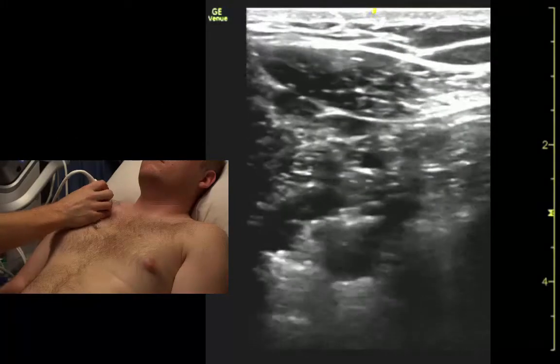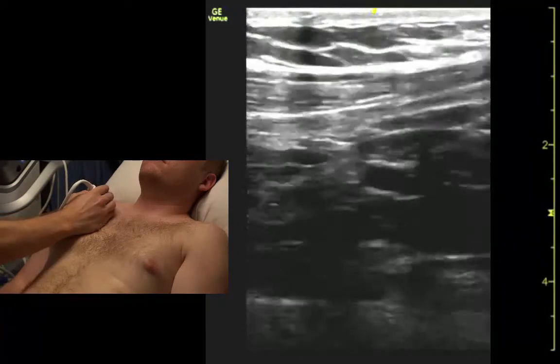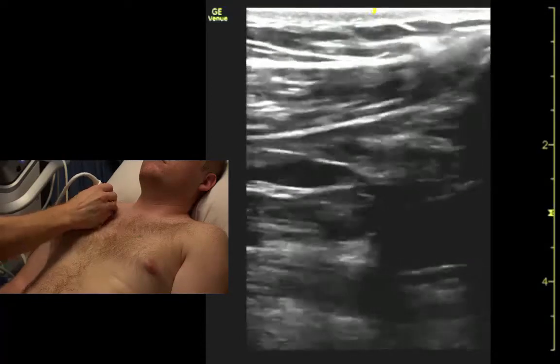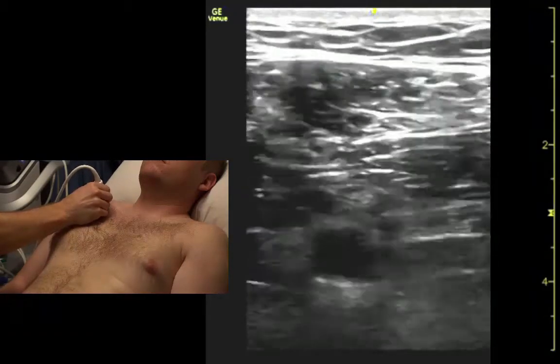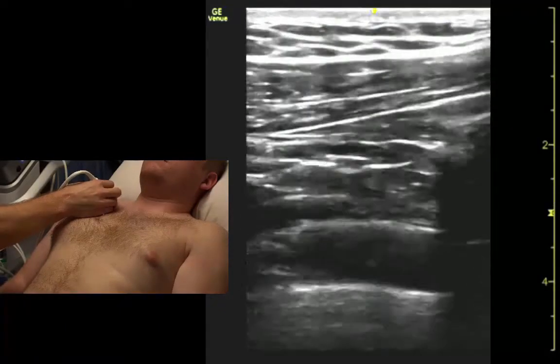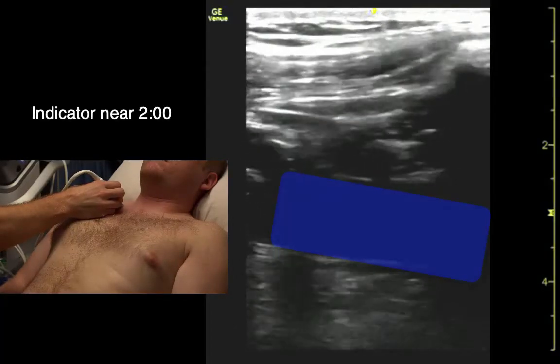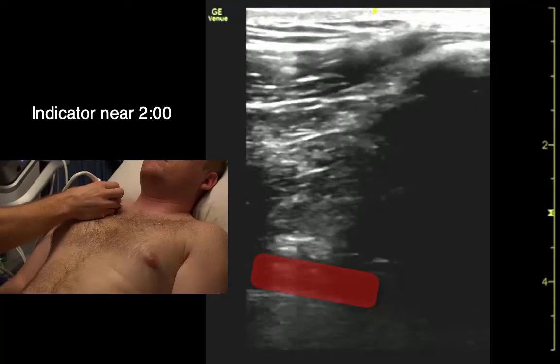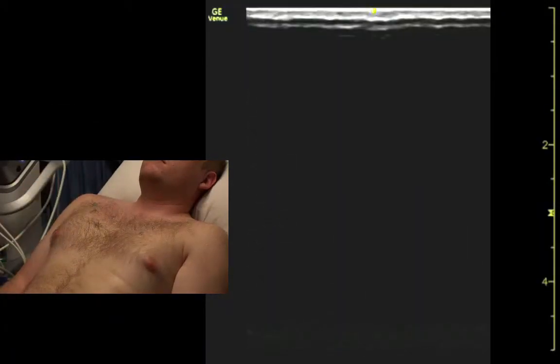If we're not sure, we can lie them back. That's a good target for central access too. Bear down again — there's the vein, we could target that for central access. The artery's a little bit deep. Or if we flip him on his head, then it's a good target that way.